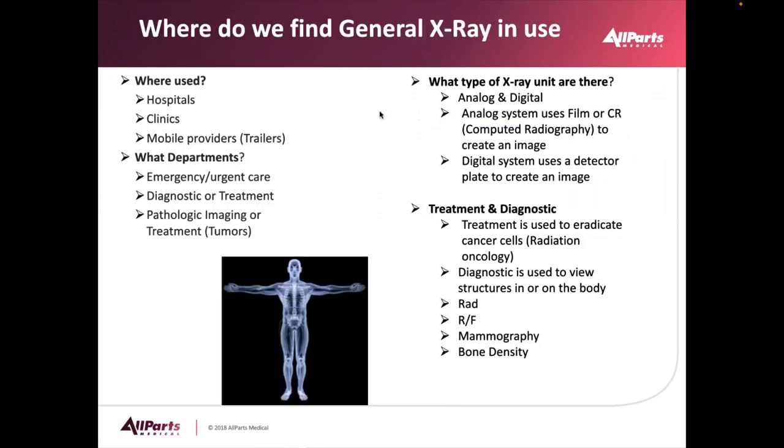So where do we find X-ray in use? We find it in hospitals, clinics, and mobile providers, which are trailers. We find it in the following departments: emergency rooms, urgent care. There is diagnostic or treatment or pathological imaging.